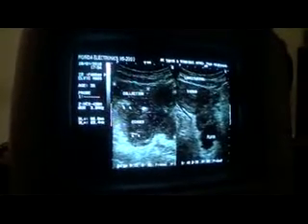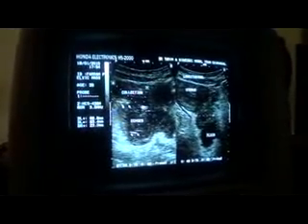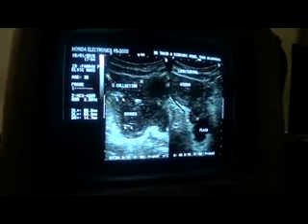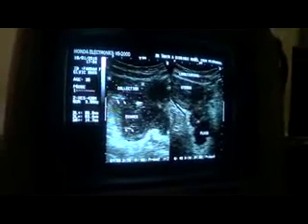This breach that we see measures approximately 14.7 mm, and this area, a thick echogenic band, is in fact the mesentery, thick mesentery. Now this mesentery is so far confining the collection up to the pelvic cavity and the right adnexa, and then up to the right iliac fossa.